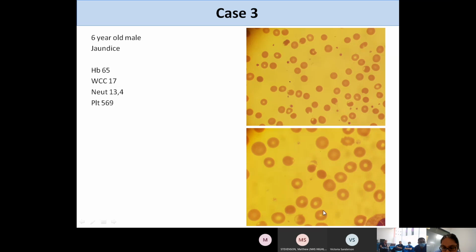And you can't see it, so I didn't do a close-up of it. And then here and here, and probably better here, it looks like the red staining of the cell has been squished to one side, and one side of the red cell almost has no hemoglobin in it, no staining. This is called a hemighost. You get these changes when you have denatured hemoglobin that gets bitten out of the cell when the red cell passes through the spleen.